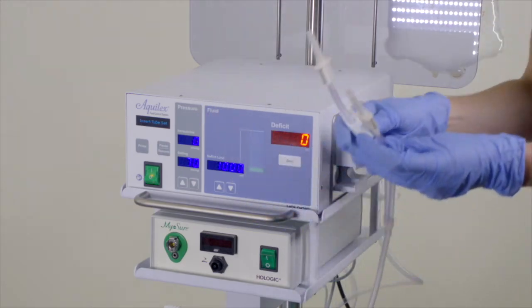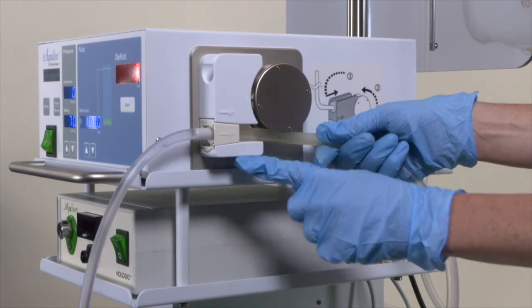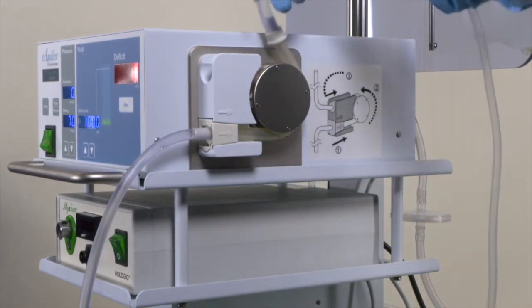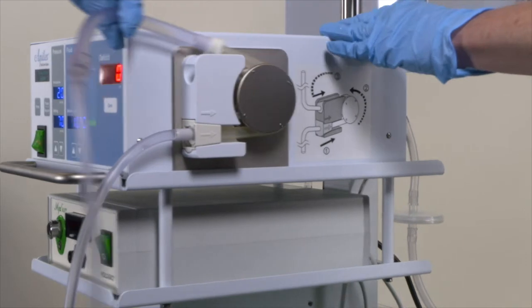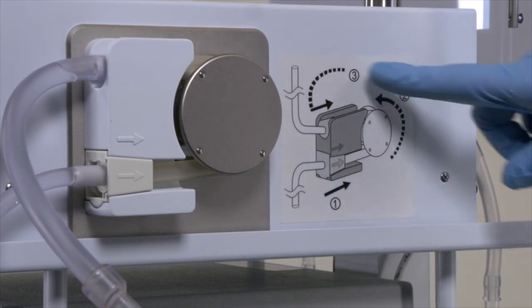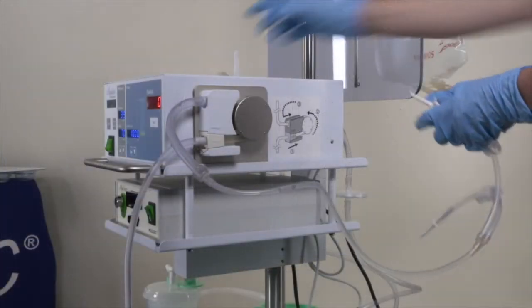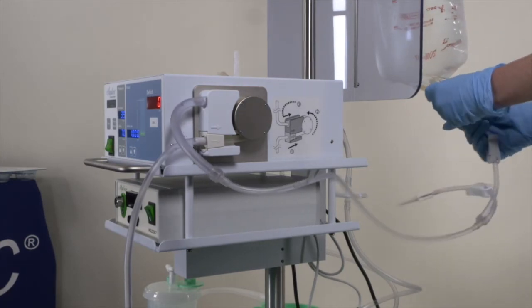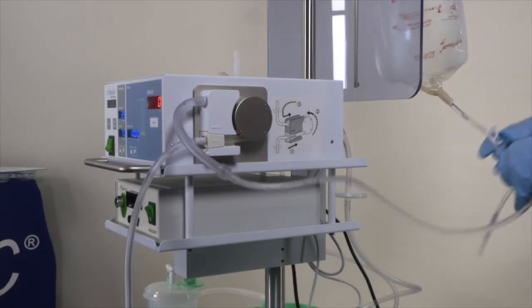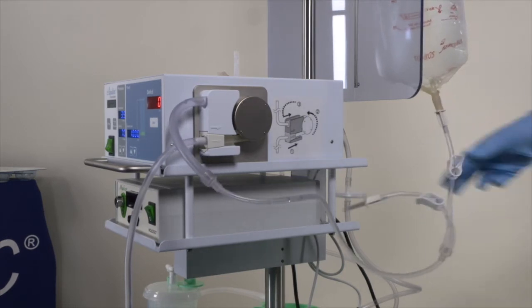The circulator will align the arrow on the microchip and slide it into position, and then wrap the tube around the pump wheel, gently stretching it into the housing as shown. A diagram on the pump will help remind you of the steps to insert the tubing. You will hear an audible sound when the microchip is correctly housed. Clamp both clips next to each spike and then spike the bag of saline. Unclamp the clip connected to the saline bag. Inflow setup is now complete.